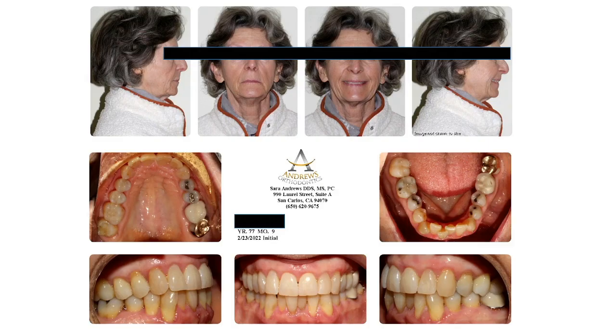So this is a class 1 severe crowding. This is an older lady. The reason I want to show you this case is, don't be afraid of gingival recession. I used to be afraid of it. I used to tell them, oh, I can't treat you. I'm not afraid of it anymore, because I know how to move those roots. So are they going to come forward? Yeah, sure. But I need to control which ones are going to come forward. This is the nice thing about Invisalign. You have control on every single tooth, and you can really spend time on your ClinCheck and move every tooth individually. It's pretty cool. So her concern was mandibular crowding.